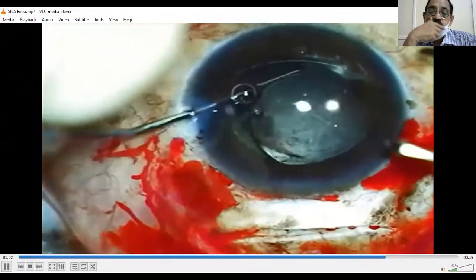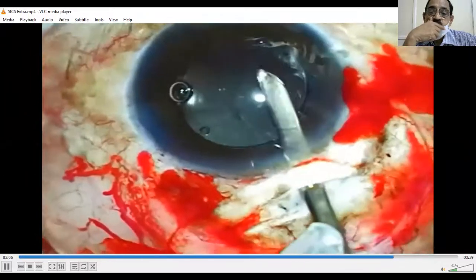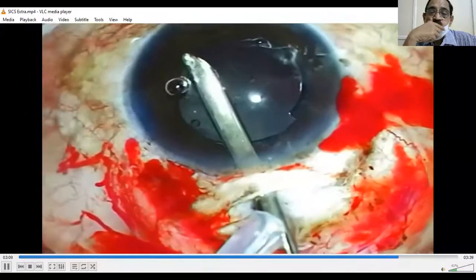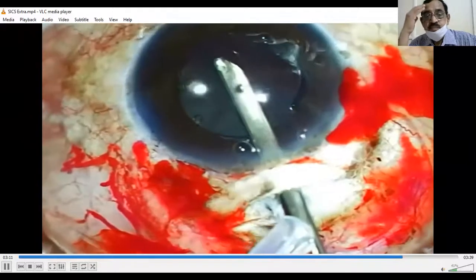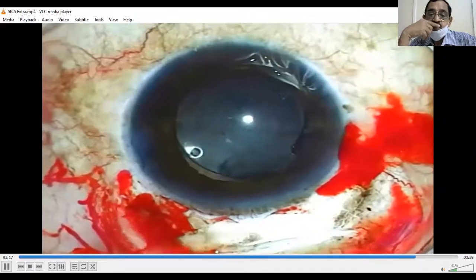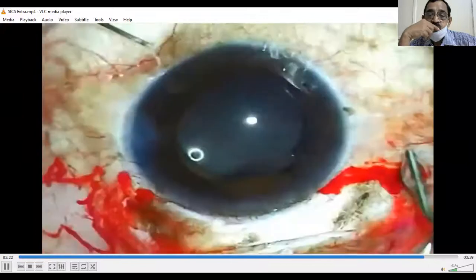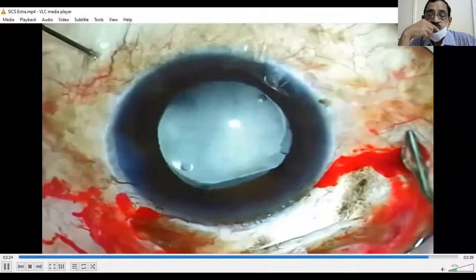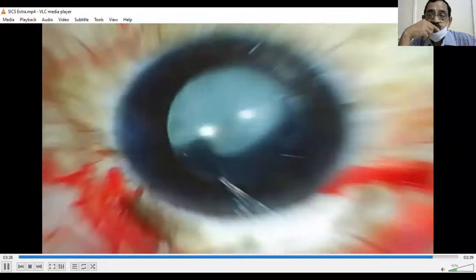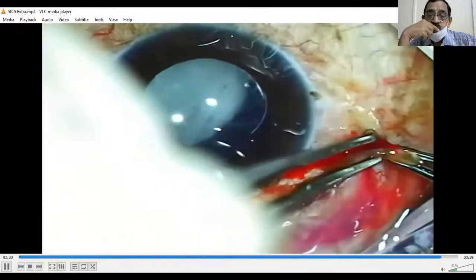Once the lens is in the eye, the Simcoe cannula is again used to remove the viscoelastic via the main incision. The incisions are then hydrated with a BSS cannula, and the eye is checked to ensure that it is watertight. In this instance, I'm giving an intravitreal injection of triamcinolone and moxifloxacin mixture. The conjunctival peritomy is then closed with cautery, and the case is terminated.